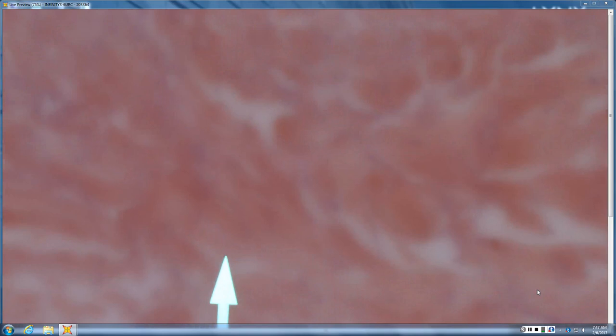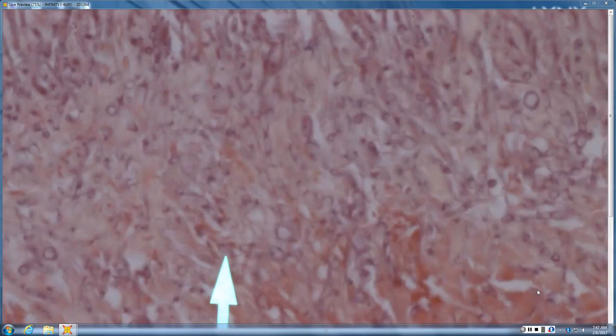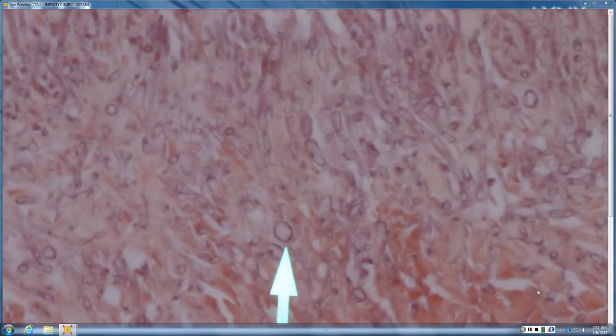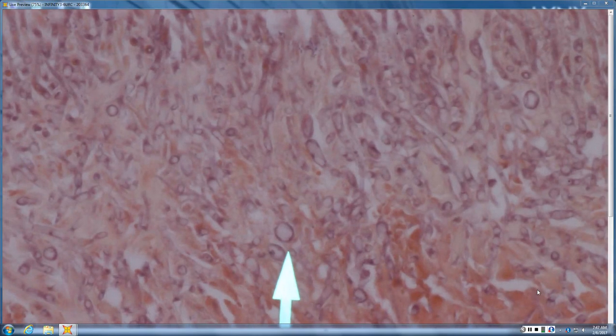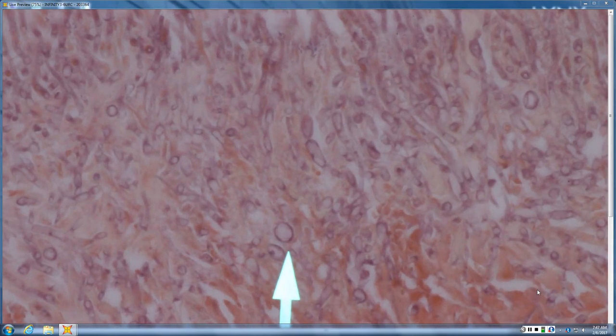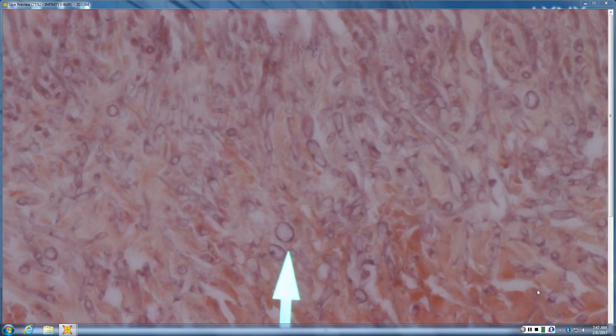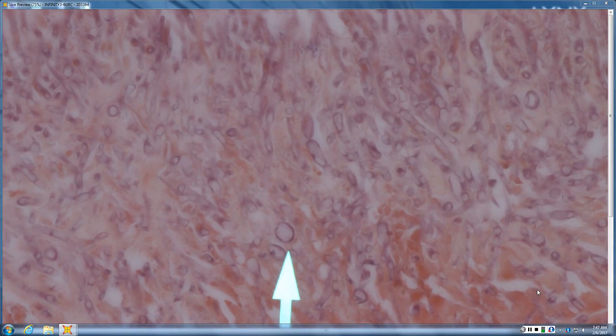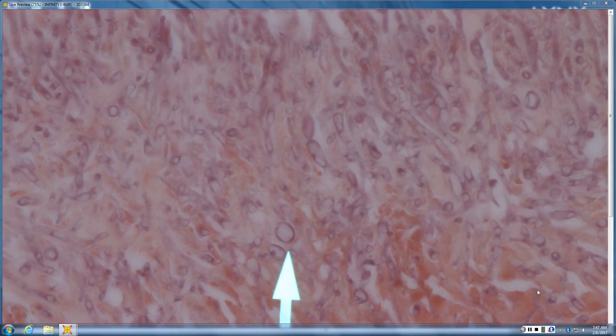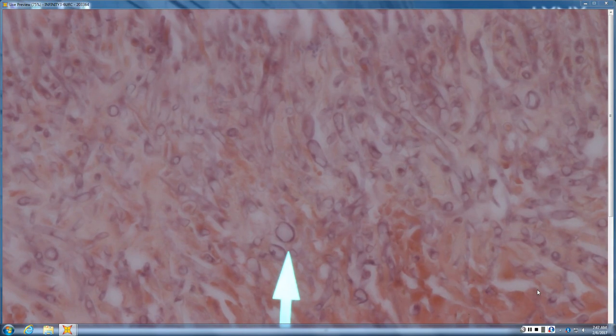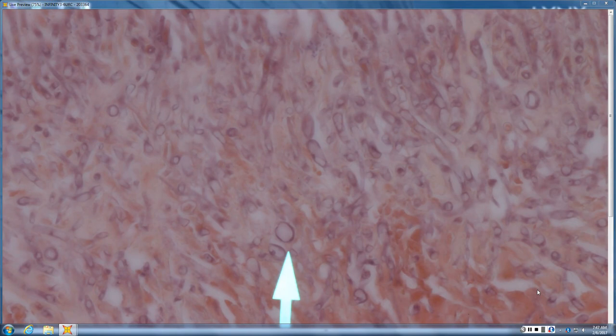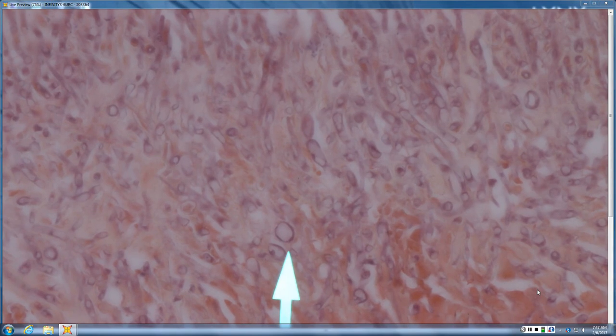Yeah. I mean, there's really not much of a wall there at all. It's just bubbly cytoplasm in hyphae. And in areas, they make these soap bubble-like swellings. So, what has hyphae with blue bubbly cytoplasm, essentially no visible refractile wall, and a tendency to form soap bubble-like swellings? Anyone want to jump in? Fusarium. Fusarium.